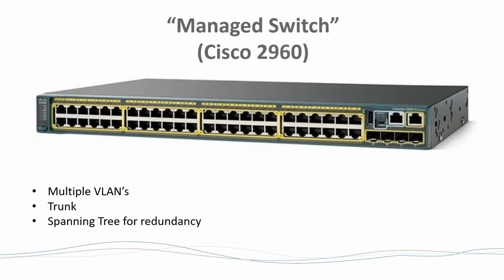And lots of them have lots of them. This is a layer 2 switch. Now you'll hear layer 2 switch and you'll hear layer 3 switch. At the end of our workshop today, I hope you'll know the difference when somebody talks to you about a layer 3 switch. So multiple VLANs, spanning tree, and it does a thing called trunking as well that we're going to talk about.